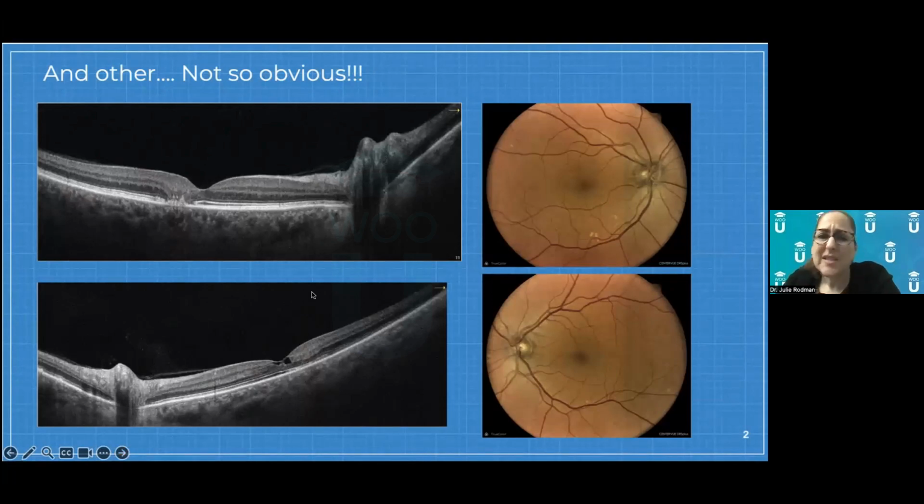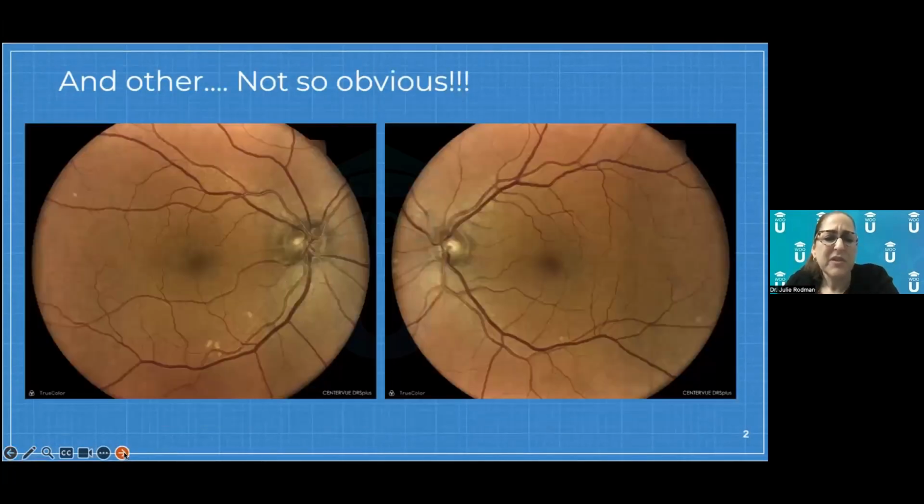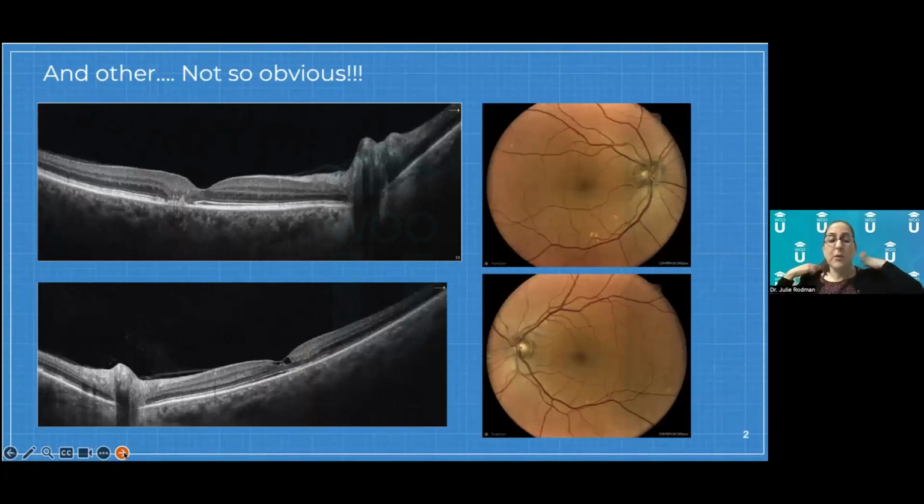So I look at the OCT. I believe this patient, I didn't put the vision here, but I believe the vision was slightly reduced, which is the whole reason that we went ahead and did OCT. You can see here that I don't see an ILM drape. If I had gone through the scans and put a bunch of them on here, perhaps it would have picked up on that. But what you would notice is some of the loss of the photoreceptors here. So this eye is a little bit more difficult because we're not seeing that first stage, but the left eye gave it away.